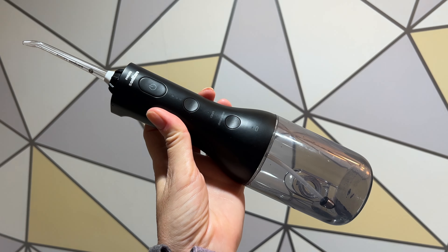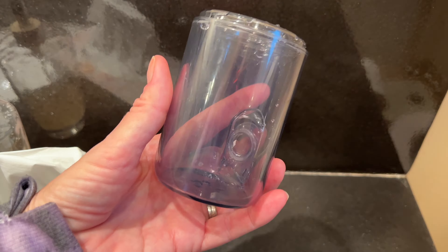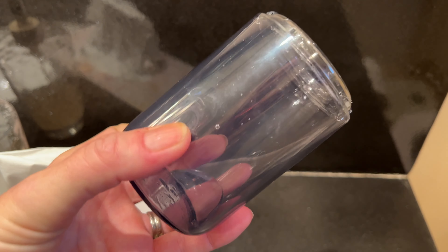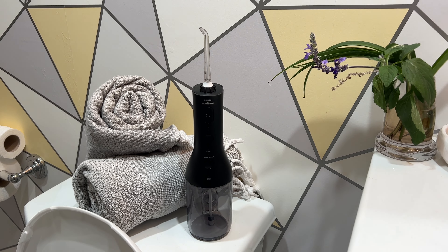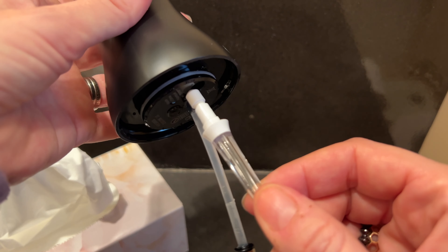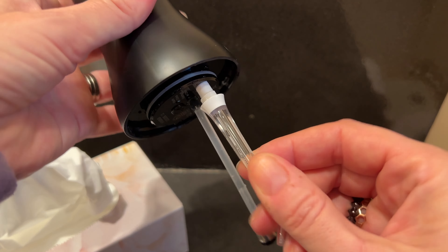Philips says you should clean your power flosser about once a week by cleaning the water reservoir either in the dishwasher or using soap and water. You can also run vinegar water through it to give it a deep clean if needed. One neat little extra feature is that you can store your flossing nozzles inside the water reservoir by inserting the bottom of the nozzle into the bottom of the power flosser. I also found out you can use mouthwash mixed with water in the reservoir, and you can use it to clean orthodontics and presumably dentures too.